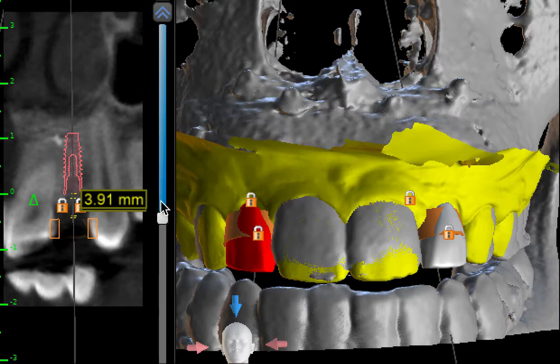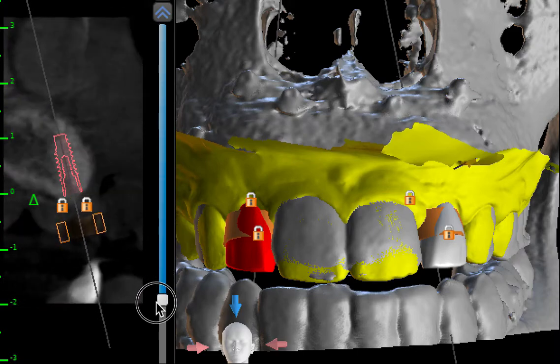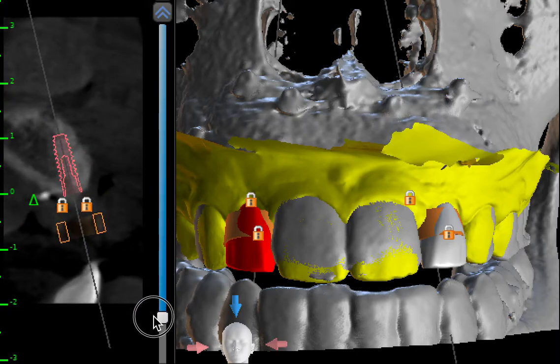Alright folks, I'm uploading this video because I'm planning this case right now for replacement of two congenitally missing lateral incisors. The site that you see here and both sides have been grafted before in order to place those implants, and you can see the amount of robust bone that we have achieved. This is the left lateral incisor, plenty of good bone there. What you see there is a Meisinger master pin from our ridge augmentation.